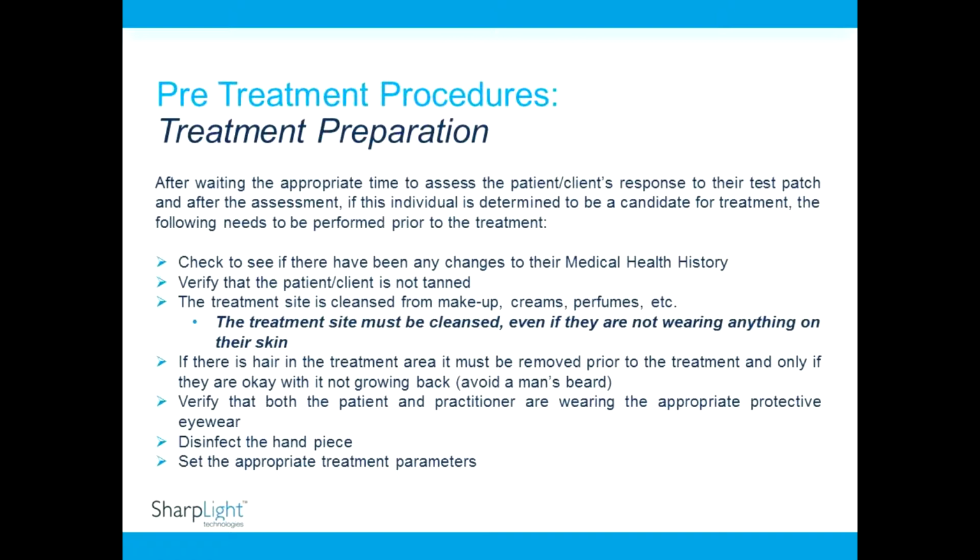If there is hair in the treatment area, it must be removed prior to the treatment and only if they are okay with it not growing back. Avoid a man's beard. Verify that both the patient and the practitioner are wearing the appropriate protective eyewear. Disinfect the handpiece. Set the appropriate treatment parameters.